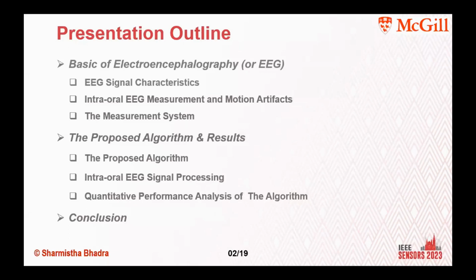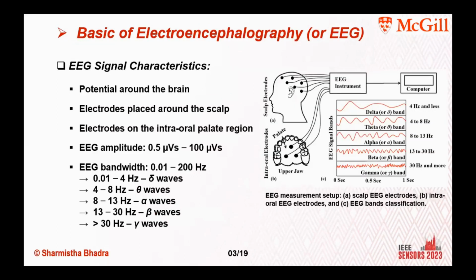First I'm going to talk a little bit about the intra-oral EEG measurement that we have done previously and the measurement system, and why we actually went for the motion artifact removal. Then I'm going to talk about the algorithm that we used to remove the motion artifact, and then conclude the presentation.